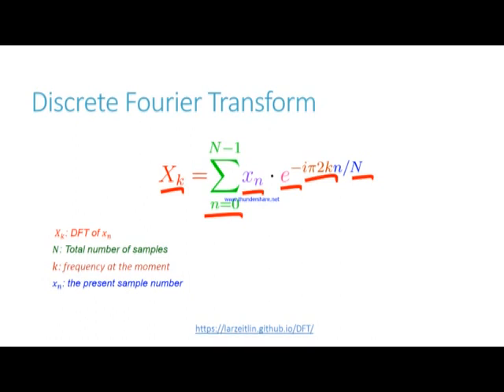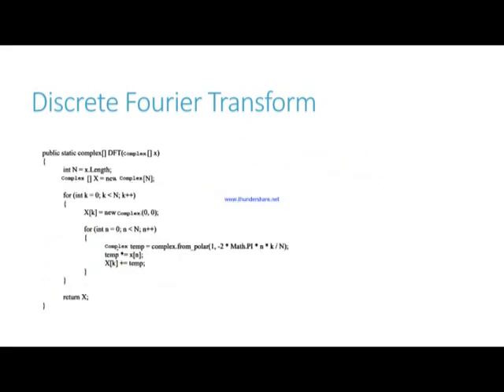Notice that each time domain sample is multiplied by a complex number. This calculation can be achieved with a very simple function, as can be seen here. Notice that this function takes as an argument an array of complex time domain samples and returns an array of spectrum data with the same number of elements as the time domain dataset. Each element of the spectrum dataset corresponds to a particular frequency related by the frequency resolution of the sample set.